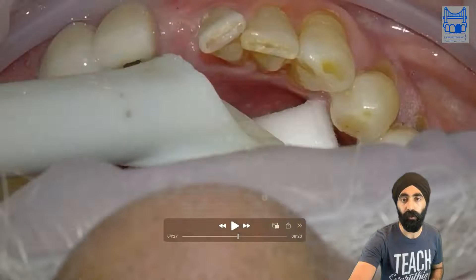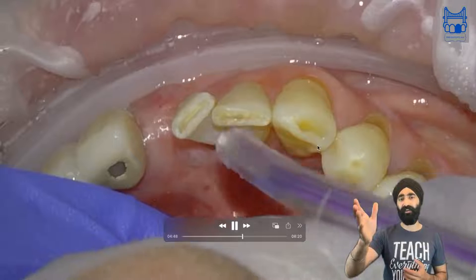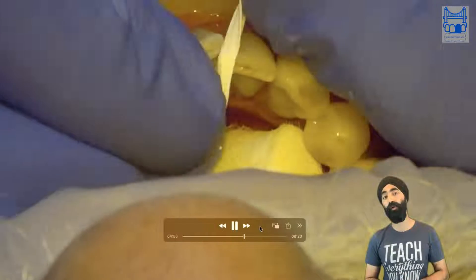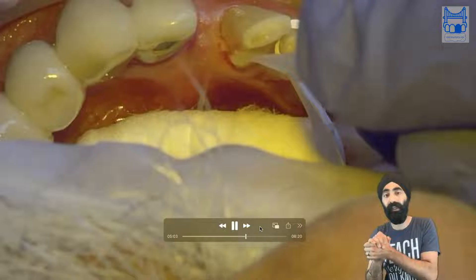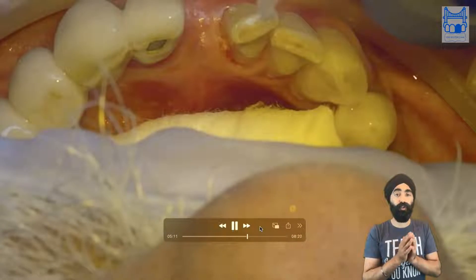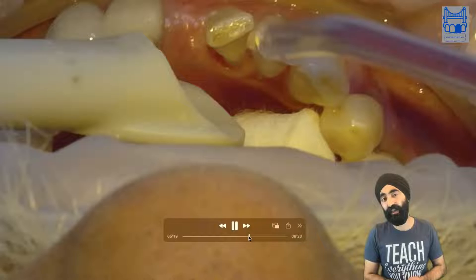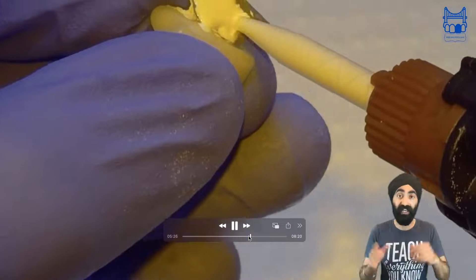I'm getting plenty of etch on there. We get it washed — the usual stuff — get some cotton rolls in and you see a beautiful etched surface. That's what I want. I've got the orange filter on so we don't end up curing anything accidentally. I'm getting the tooth primer — follow whichever cement you use. I suggest something like Panavia or Rely X Ultimate which has MDP. The research shows MDP is what we need to bond a resin bonded bridge to enamel. I'm using the Panavia tooth primer on the nicely etched and clean tooth. I'm using the opaque cement — Panavia does different shades and the opaque one is good. It's my general protocol because it basically prevents tooth greying compared to using a translucent cement.